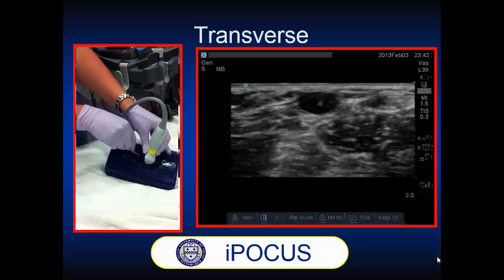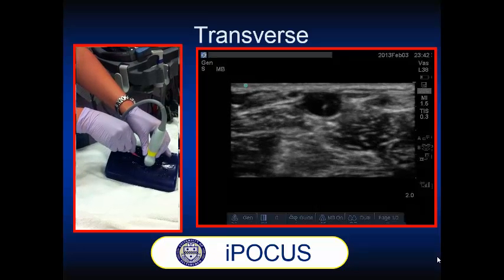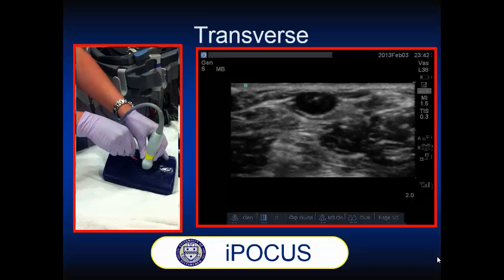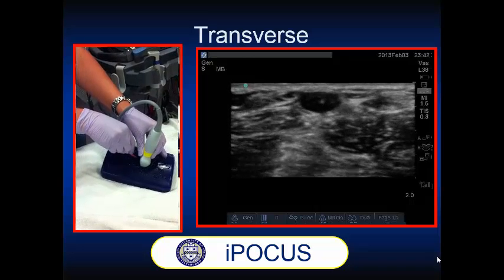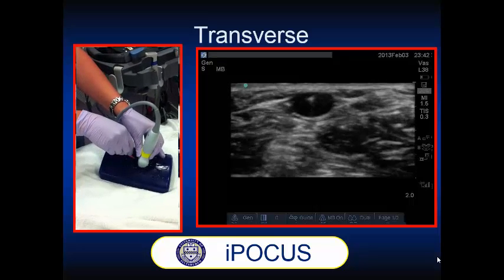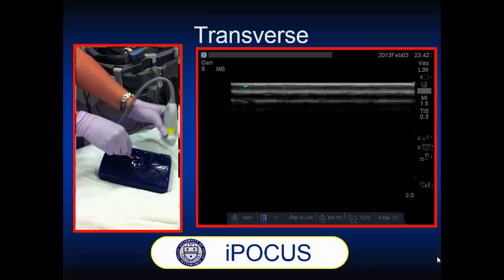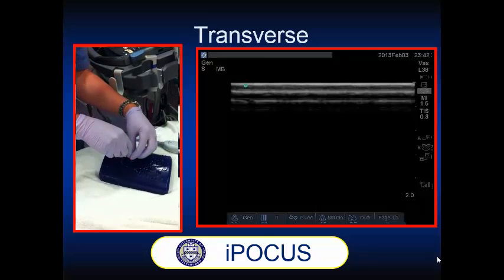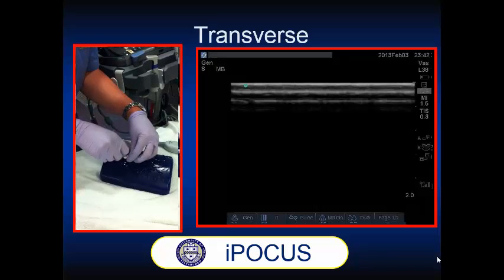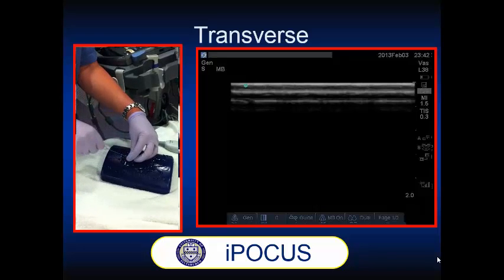Then you should again slide the probe distally until you can visualize the tip again. The needle is advanced a short distance again, and the probe slides distally. This back and forth of the needle advancing and then the probe sliding continues until the entire catheter has advanced through the skin, or you are confident that enough of the catheter has cannulated the vessel. There are different thoughts on how much of the procedure should be under direct ultrasound visualization.